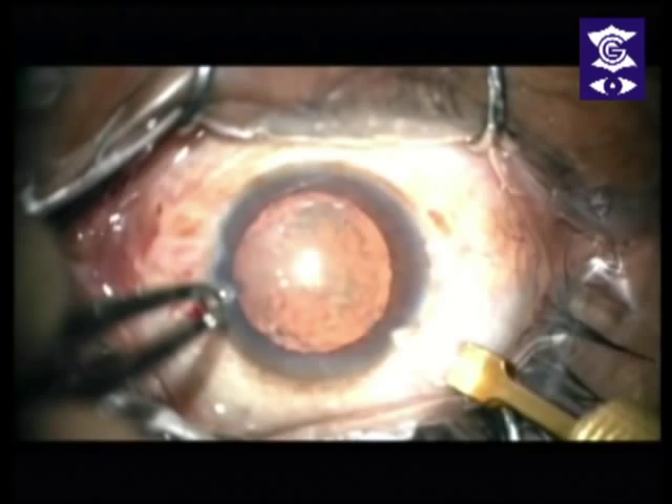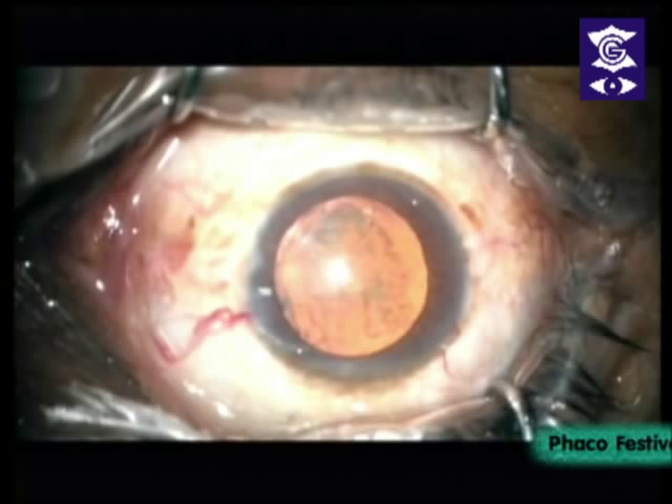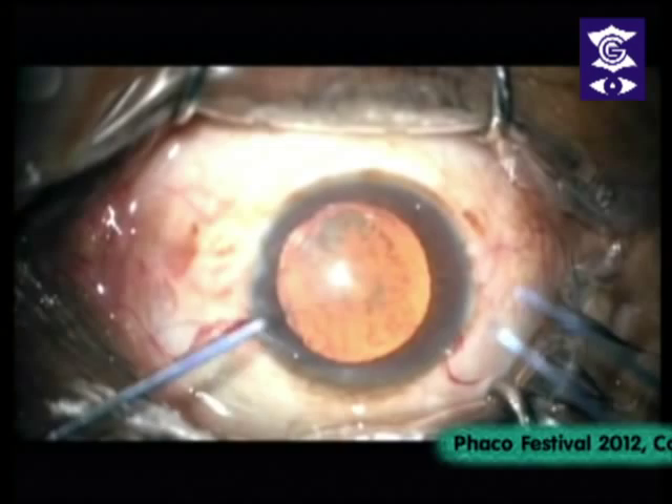Make a nice tunnel. I much prefer using diamonds because they give a nice sharp and well-delineated corneal tunnel which is less likely to leak, and you can make it the length that you want very easily.